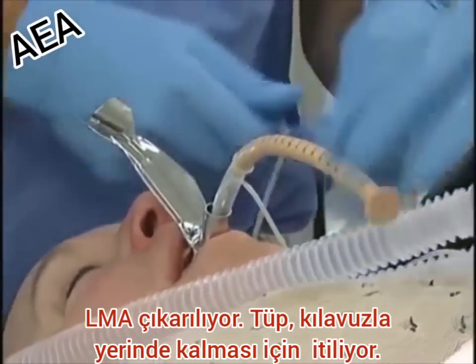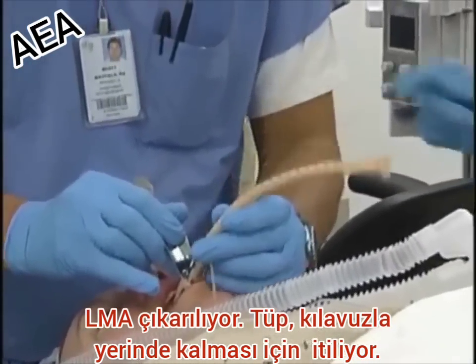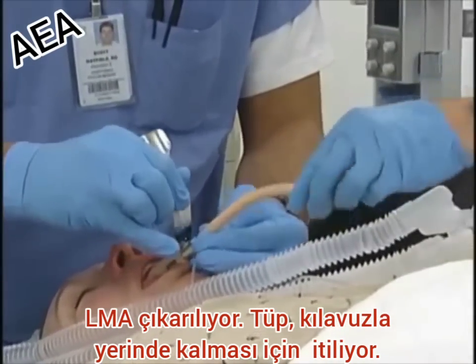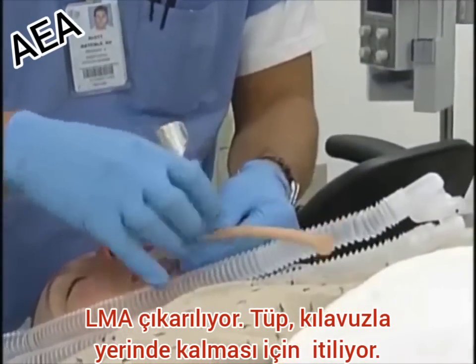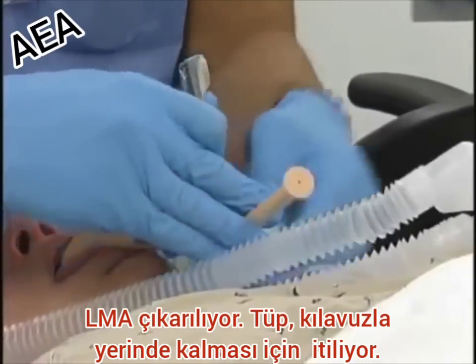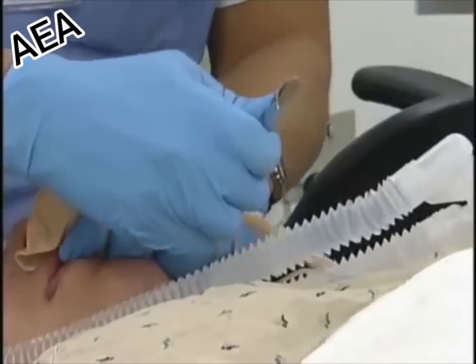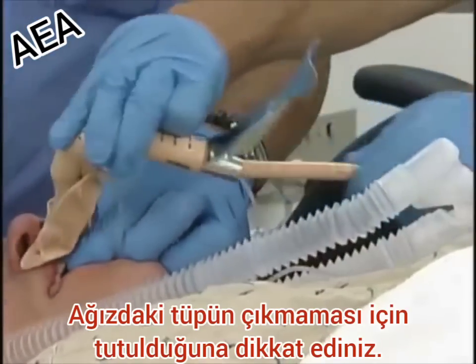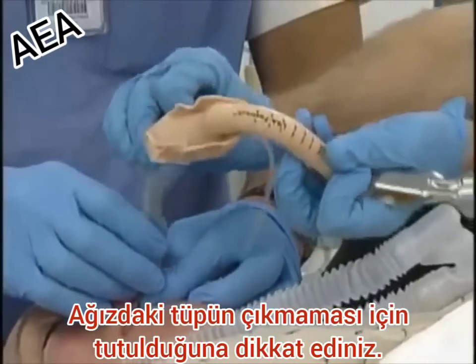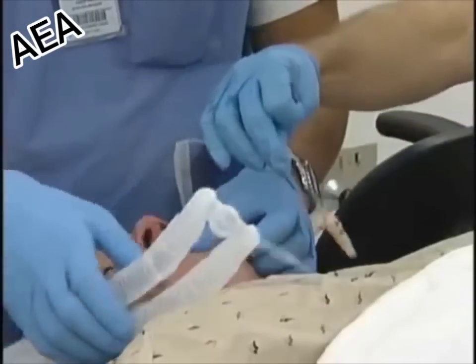Dr. Mayfield is going to advance the stabilizer rod while holding it in place as he removes the LMA component. Keep pushing this in because otherwise we'll lose position. Then Dr. Mayfield will reach around, grab the endotracheal tube, and remove the stabilizer rod. Pull the fast track cuff out.